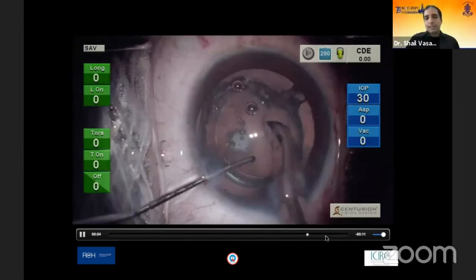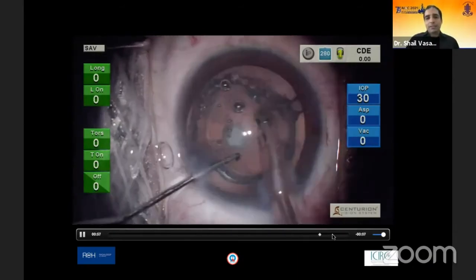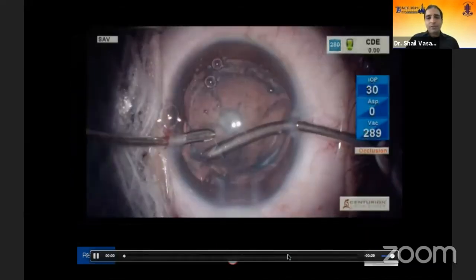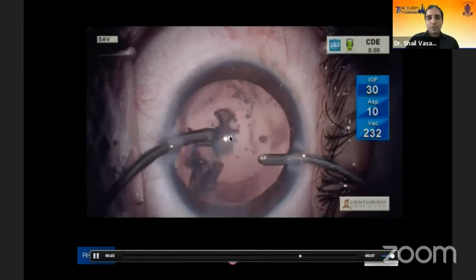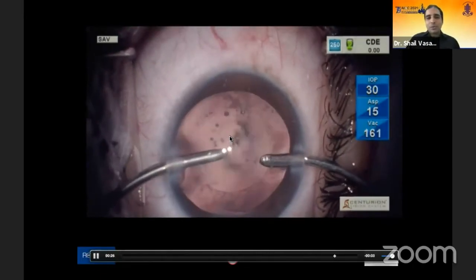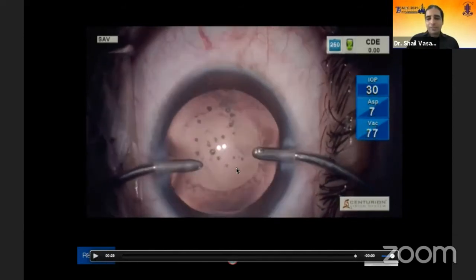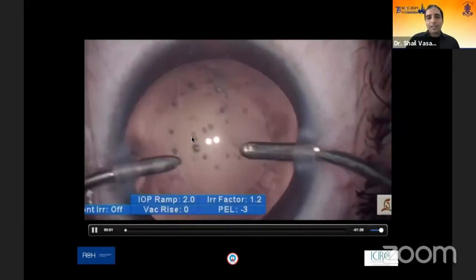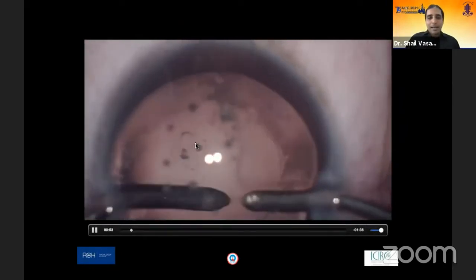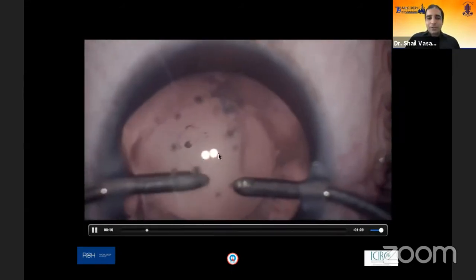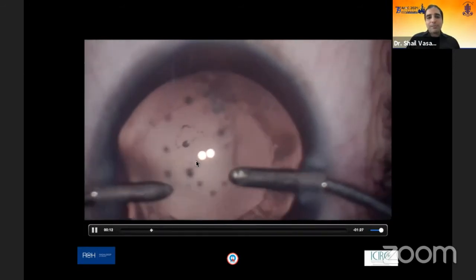We detach the epinuclear plate without fully removing it to create a communication. In this case the capsule was fortunately intact. However, thinking too highly of oneself leads to overconfidence — I attempted to polish the plaque because I was planning a multifocal IOL, and the moment I touched the delicate posterior capsule, I created a complication where none had existed.